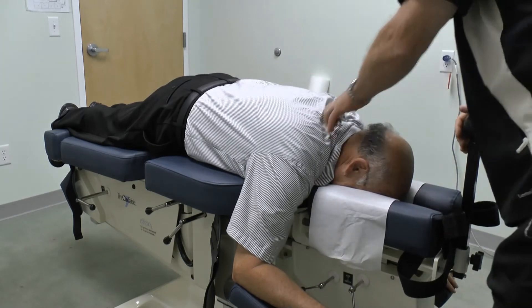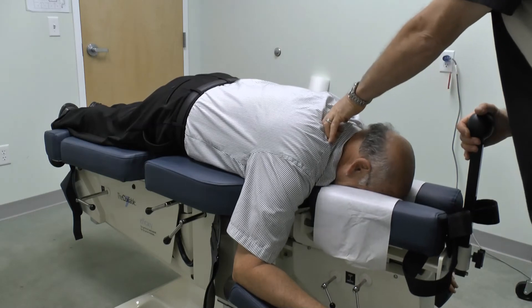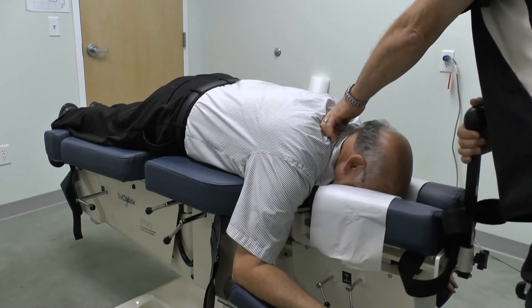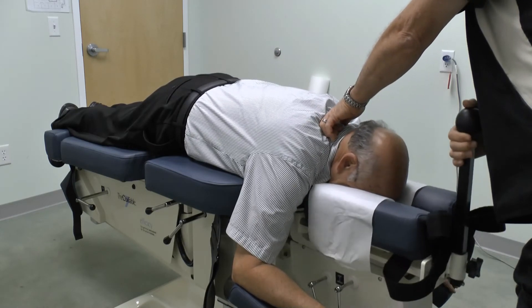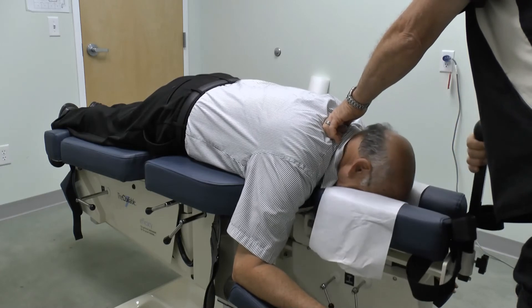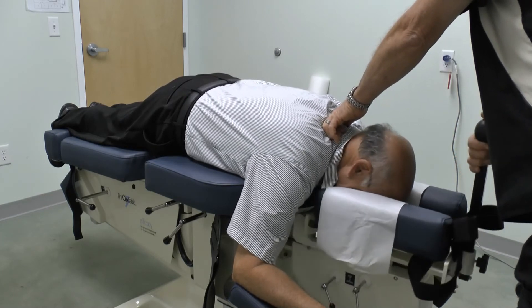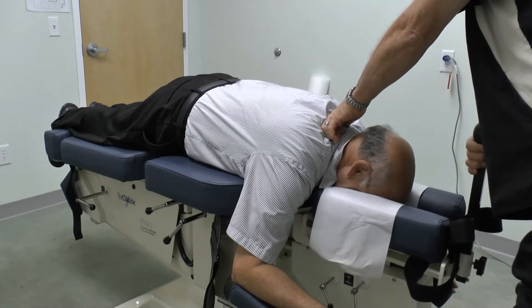Next we'll open up the flexion extension lock and do some circumduction, and circumduction in the other direction. Doing okay? Mm-hmm.